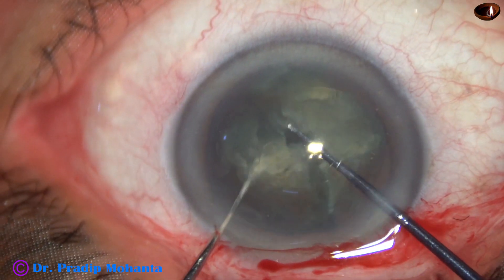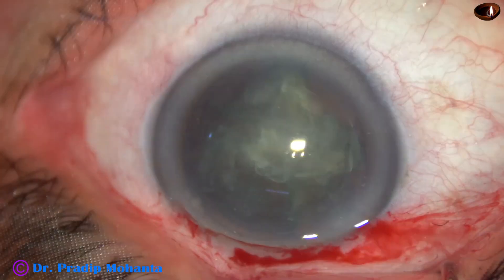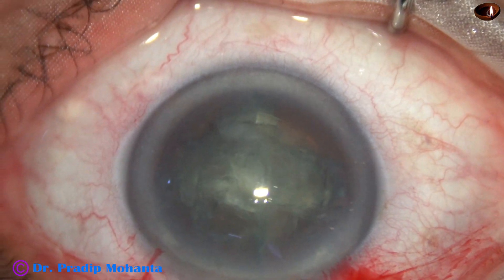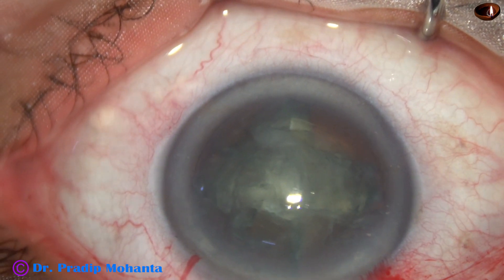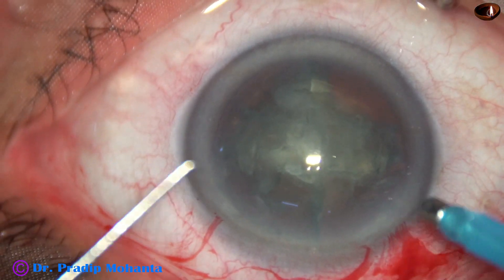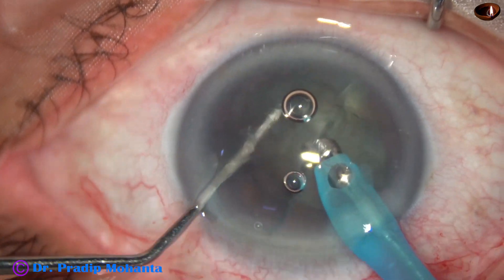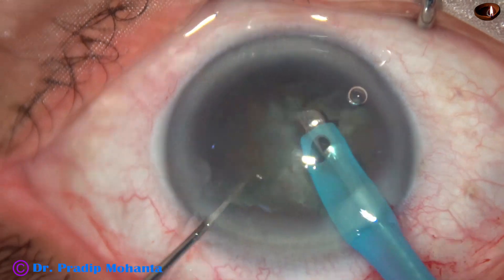We may come out in between and inject visco and retry, but in this case I was able to divide the nucleus into four pieces without coming out. There is no harm if we come out and inject visco and try again. Now we have four pieces before the FACO handpiece has been introduced. The job of the FACO handpiece is just to pick up each fragment, emulsify and get rid of them.